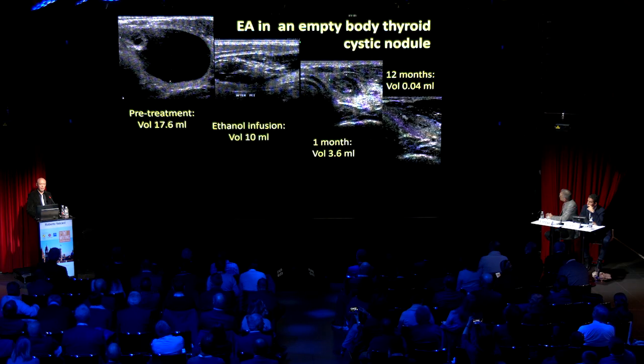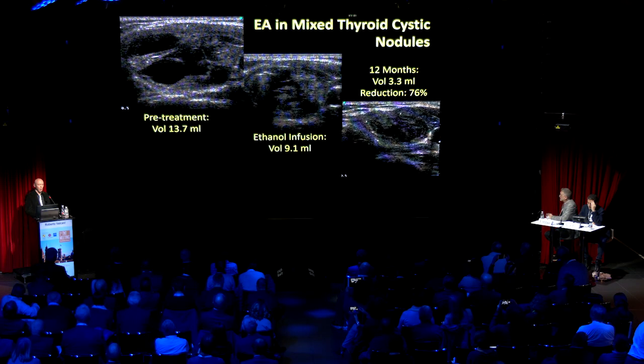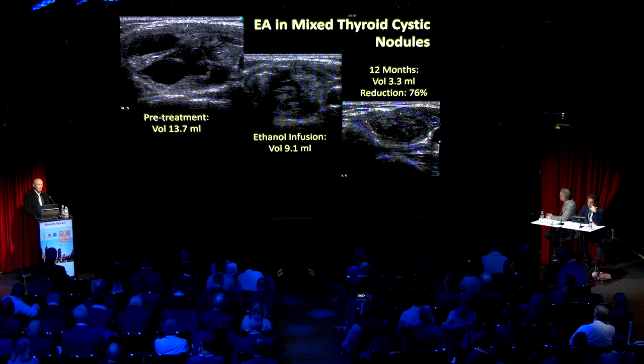So I would say this is the ideal patient to have ethanol treatment. It is not really the same with the majority of cysts, which are mixed thyroid nodules.